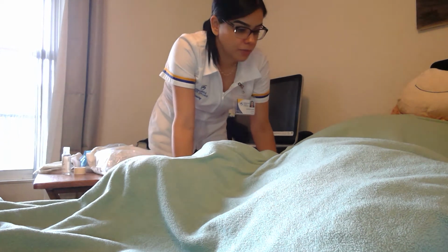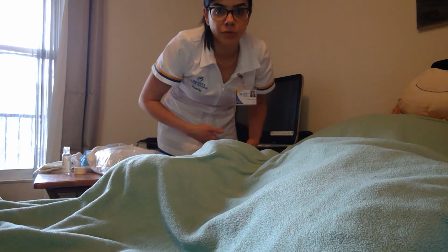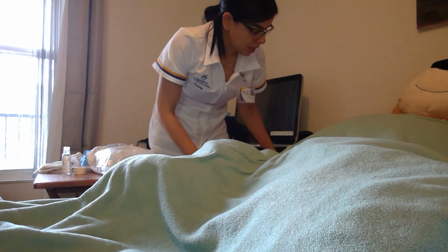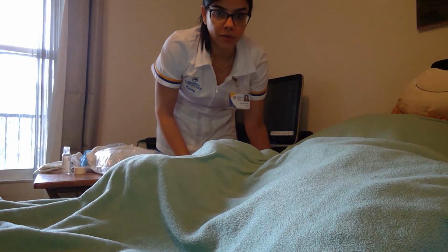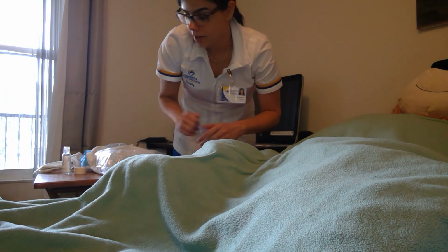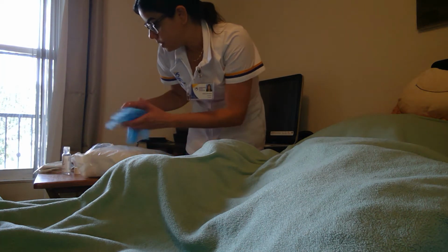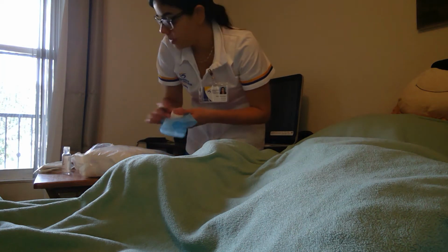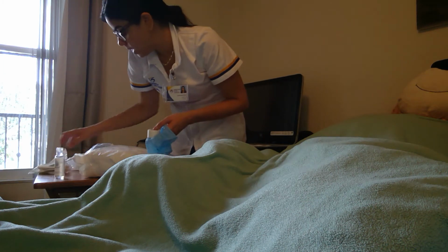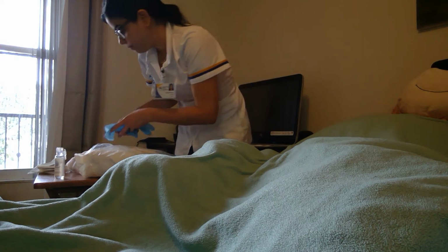So next thing we're gonna do is raise the bed to a comfortable level for me, and I would lower the rail just so I have better access to her. Okay, so I make sure that I have all of my equipment, which includes my tray, my gloves, tape, hand sanitizer, an extra pair of sterile gloves just in case, and I have here some washcloths to do some perineum care on her.